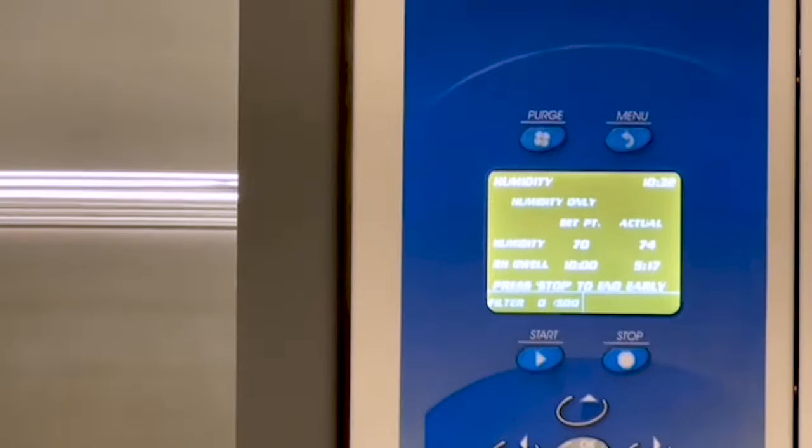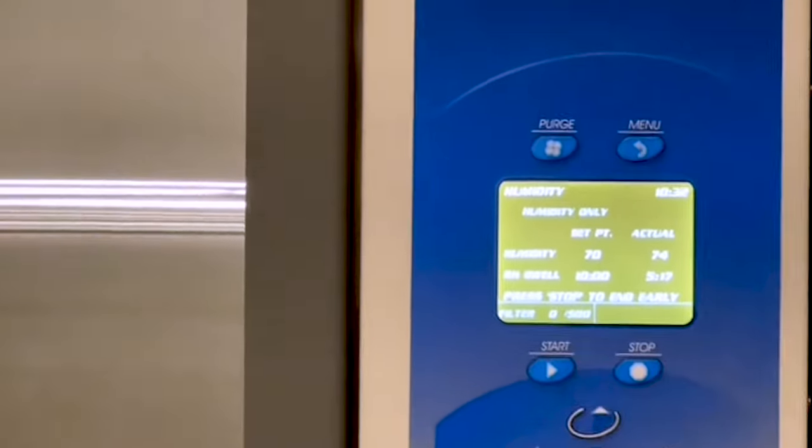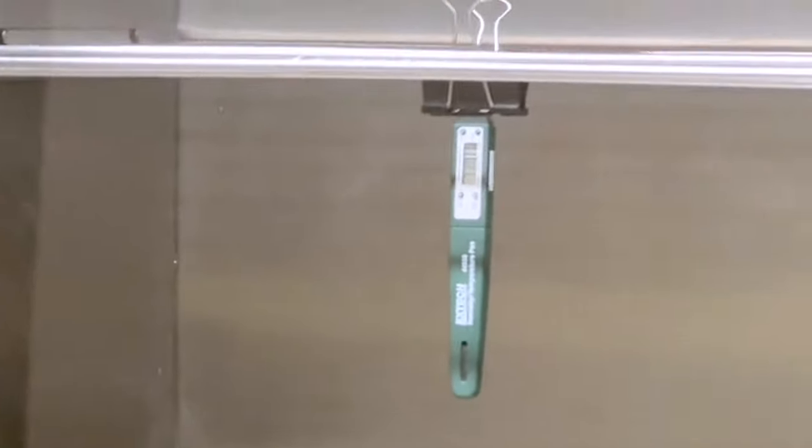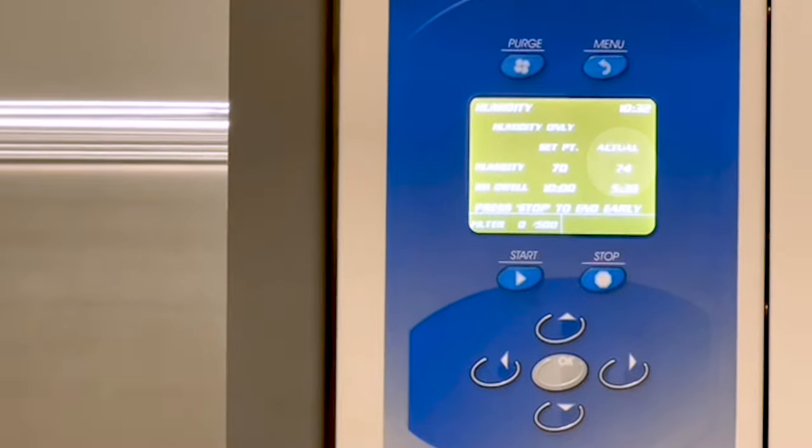When the display indicates 70% humidity has been reached, wait one minute. Then compare the reading from the hygrometer to the actual reading from the display. If the hygrometer reading is not within 5% of the actual reading, it needs to be calibrated.